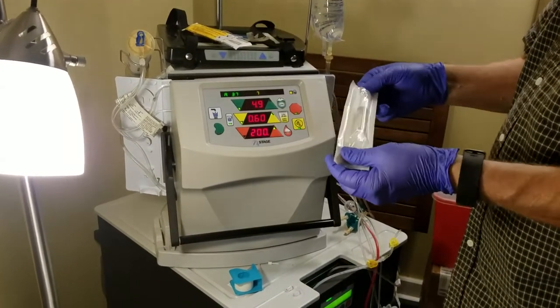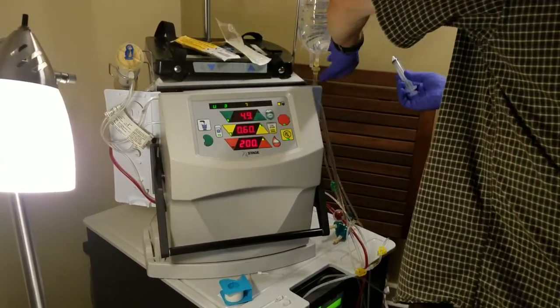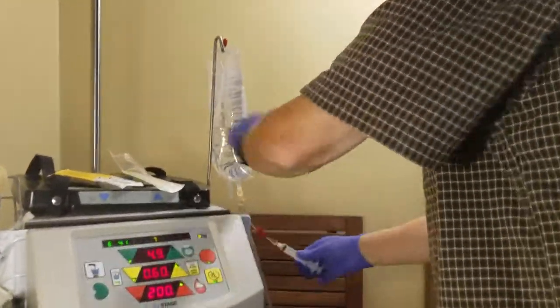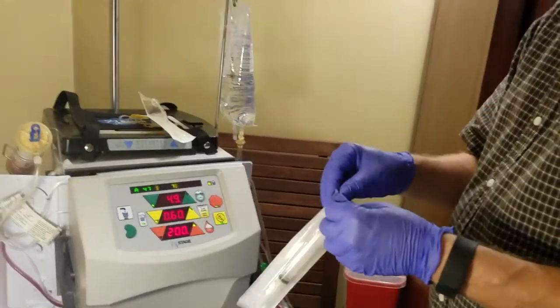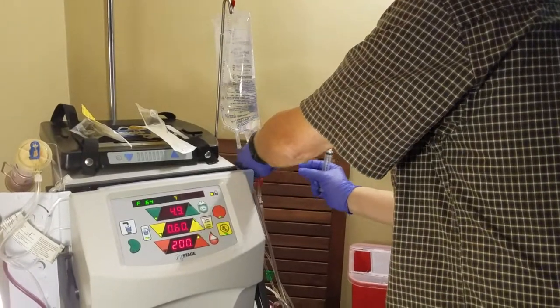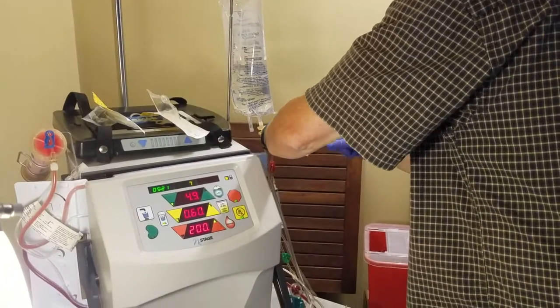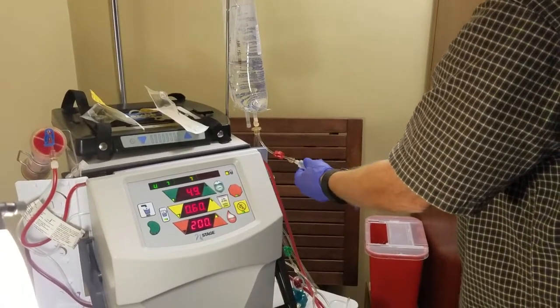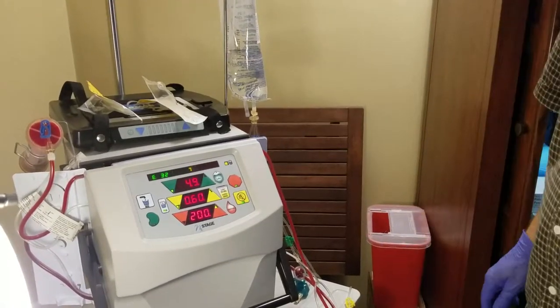One last important thing — this is the 10cc syringes that go on to the lines coming out of our bag. The red one we're gonna use to flush her venous or her arterial line at the end of the treatment. And that's why I'm gonna unlock it and bring 10cc's in there, so that it's ready to go.